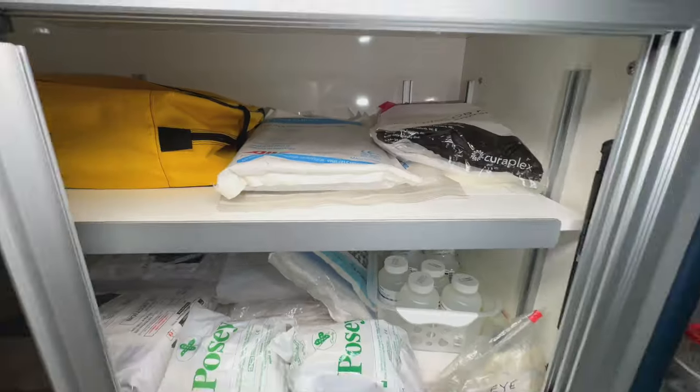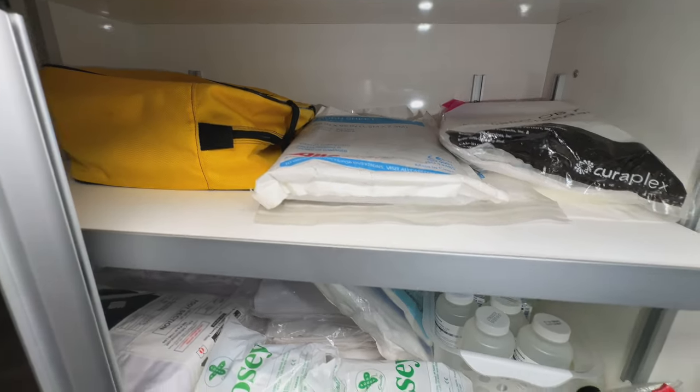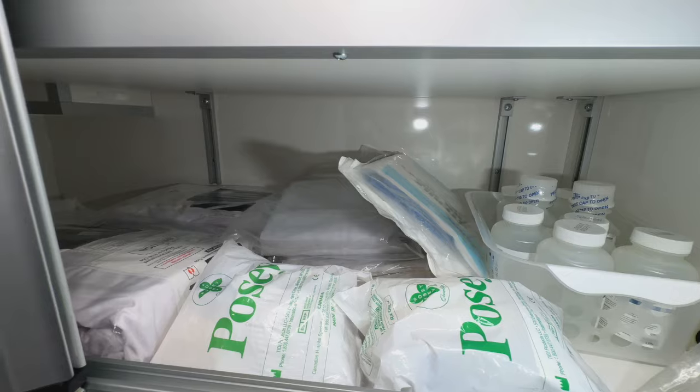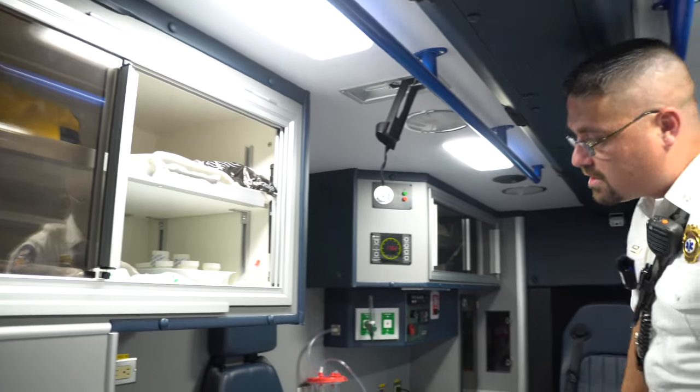We also have burn kits, trauma pads, sterile water for cleaning wounds, and restraints in case anyone needs to be secured down so they're not swinging.